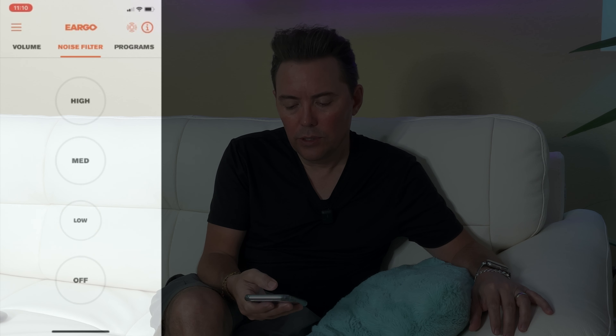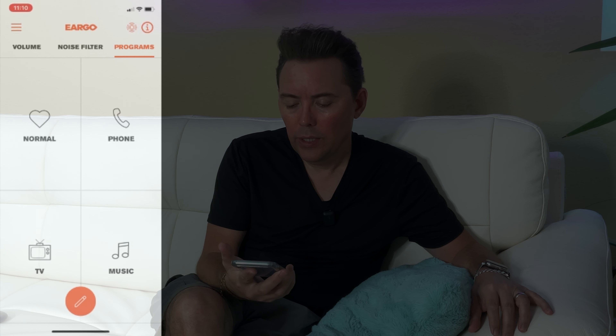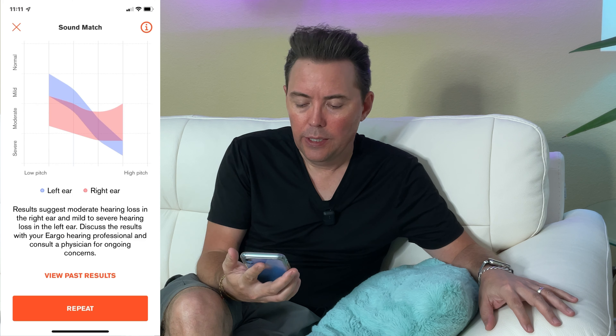The case does have Bluetooth, and there's also hypersonic technology that allows you to connect to the Ergos themselves. The app is where the hypersonic technology is built in, and there's a ton of things that this app does — I plan to do a full walkthrough. You can adjust the volume on both units at the same time, mute them, control either the left or the right individually, and go into noise filters to adjust noise filtering, which comes in handy in particularly loud environments or environments that are disruptive to your word recognition. There are also programs, which are really well set up in this app.